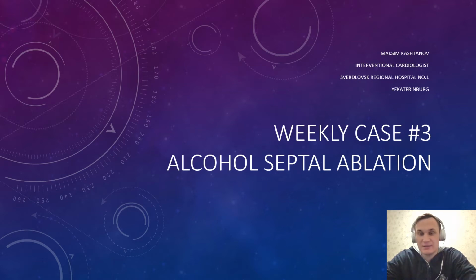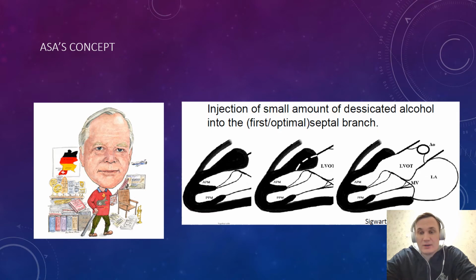Dear colleagues, let me introduce the following case. Today we are talking about alcohol septal ablation.